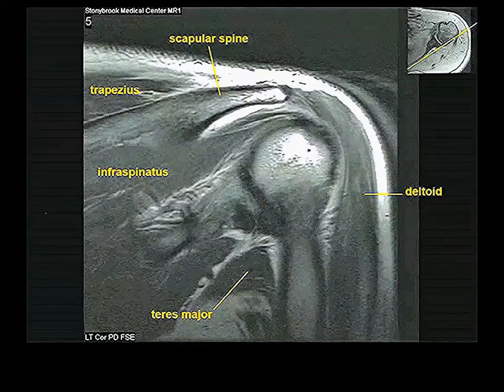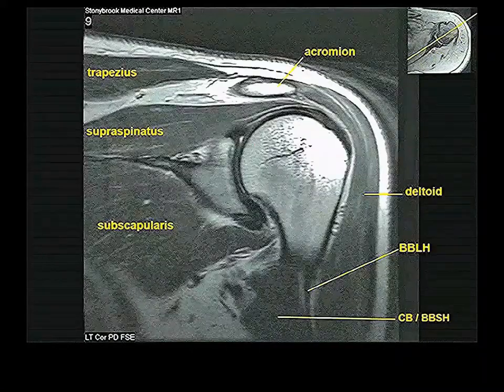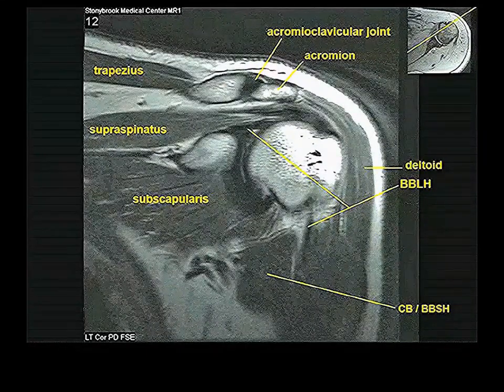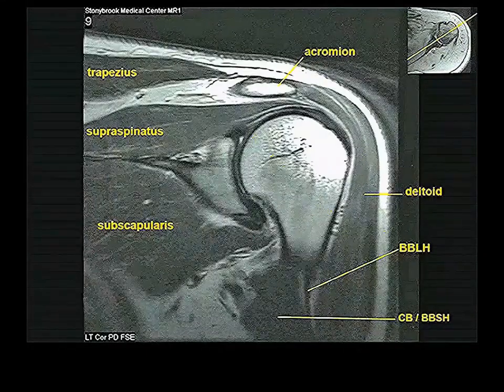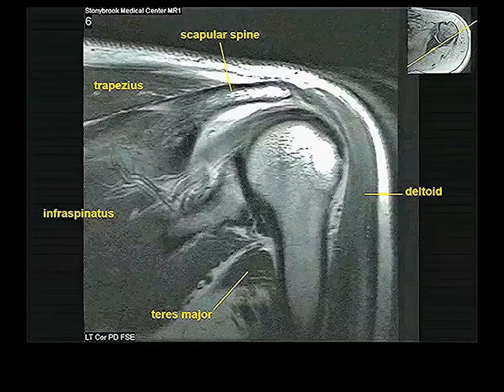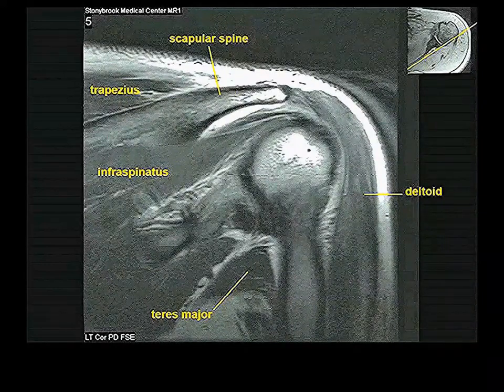And now we're getting what I think is infraspinatus. The boundary between subscapularis and infraspinatus is very, coming forward again. Here is a very clear subscapularis. Where that turns into infraspinatus is very difficult to tell because the blade itself is so thin. So you're just going right through. And I just thought that looked like it because it looks like it's passing up more over near the top of the joint.